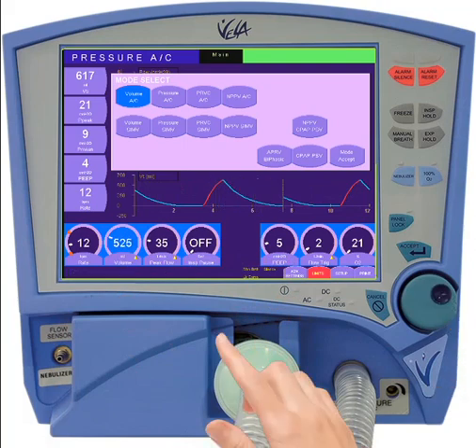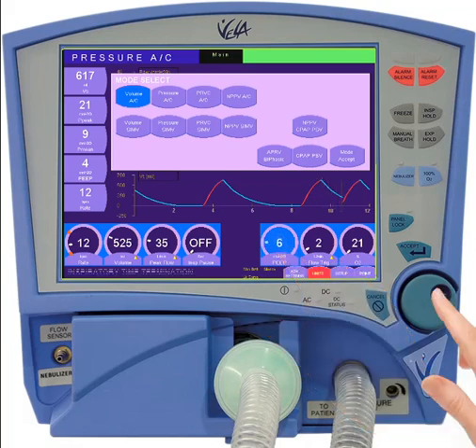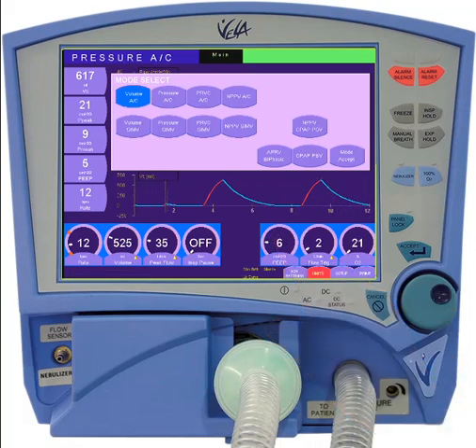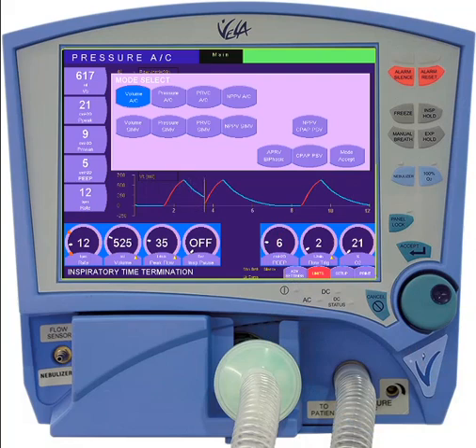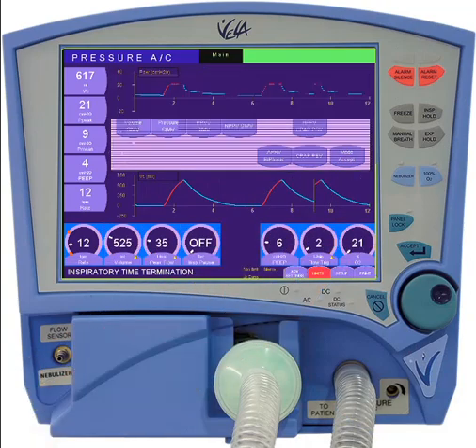To do it, simply adjust the controls using the standard touch-turn-touch process. Once they're set where you would like them, you can execute the mode change by simply pushing the mode accept button.